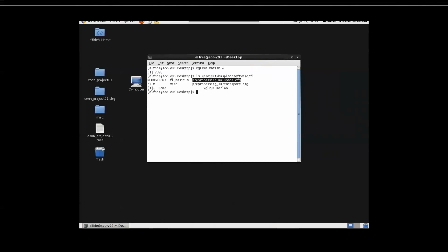Is everybody okay with that, or would you rather have the word volume in there? I think it's fine. I think MNI vol direct, MNI vol indirect. In the documentation, it just needs that one line that says this is. Sure. Yeah. Okay, so how about MNI vol underscore indirect and MNI vol underscore direct?